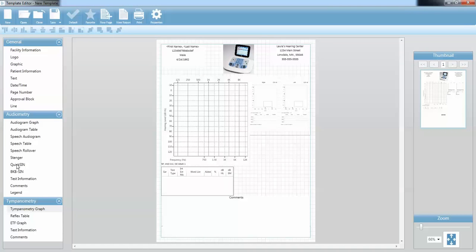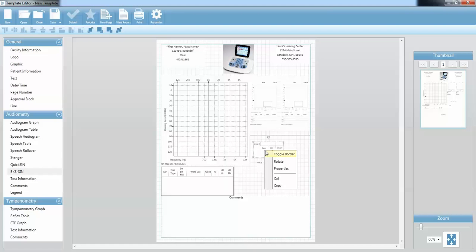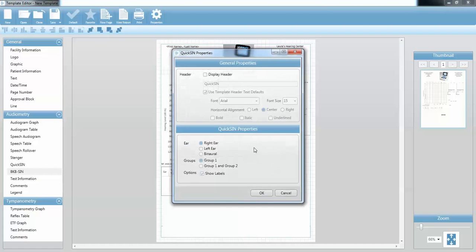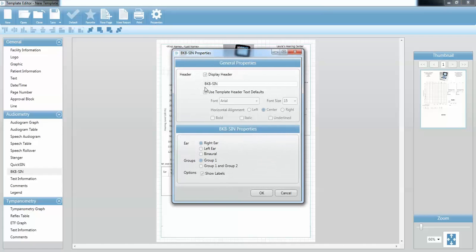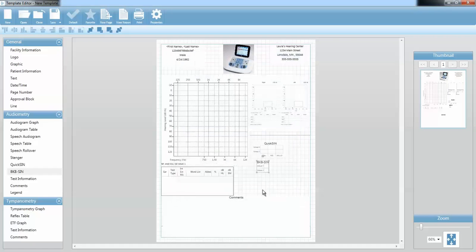I also do the BKB-SIN and the QuickSIN with nearly every one of my patients, so I'm going to drag over my QuickSIN and my BKB-SIN information. I can go to the properties — I have the display header and the different options for binaural and for the group. I can make that a little bit larger so it's easy to see. I'm going to do the same thing with my BKB-SIN — display the header, make it binaural, and show both groups. Now I have those two evaluations available.